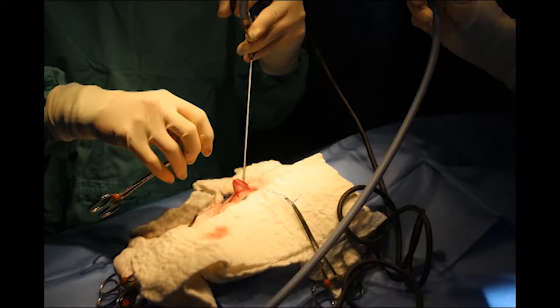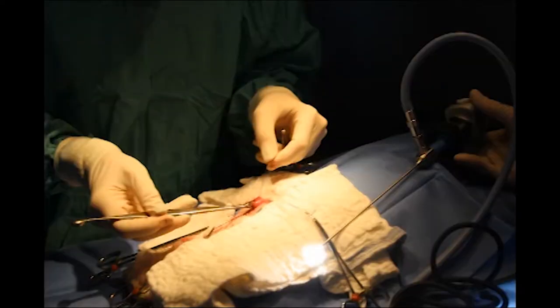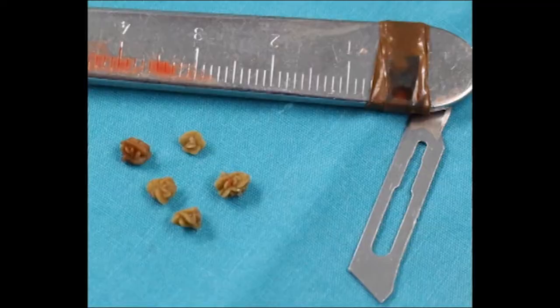Performing a cystoscopy for bladder stone removal or biopsy is also a great place to use a scope. This technique facilitates the evaluation of the urethra to make certain no stones are left behind.